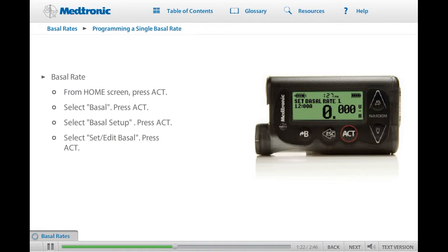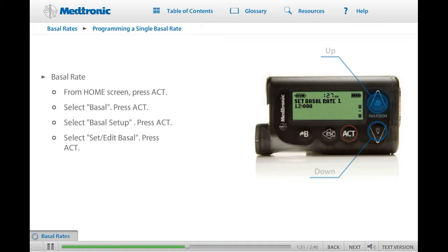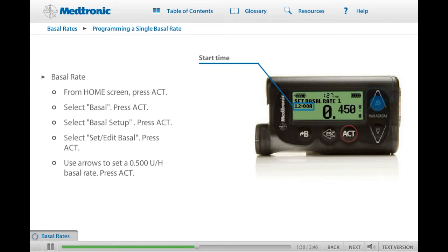On the Set Basal Rate 1 screen, use the up and down arrows to enter your practice basal rate amount. For this practice exercise, we will program a basal rate of 0.500 units an hour. Notice that the start time of your first basal rate is midnight, 12 a.m. The start time of the first basal rate is always midnight and cannot be changed. Press ACT.